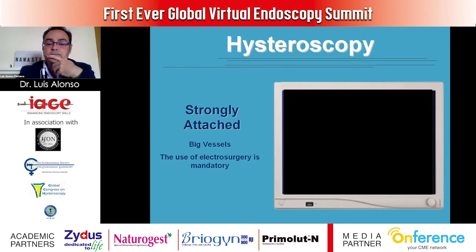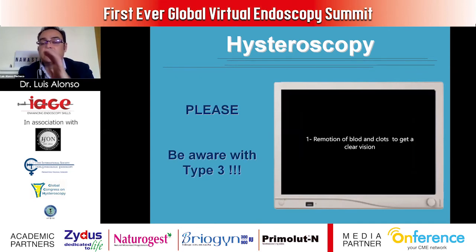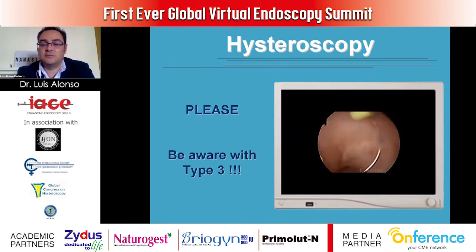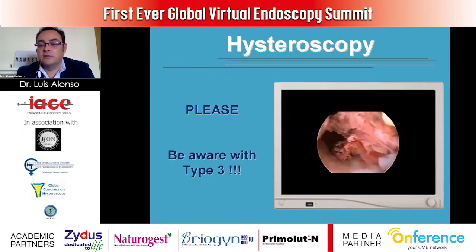Okay, so I have here a small video in which we have the different parts of this procedure. First, the removal of the blood and clots to have a clear vision, removing all that tissue so we can see properly inside the uterine cavity.